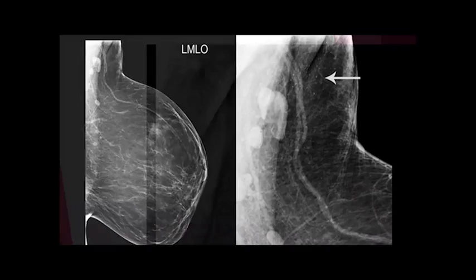They did yesterday and they didn't take a bath, so it's still on there. So we try and have all our patients wipe, no matter if they put deodorant on or not. It can even get under the skin, especially if patients wear it very heavily. They cake it on every day. We've seen it get under the skin.